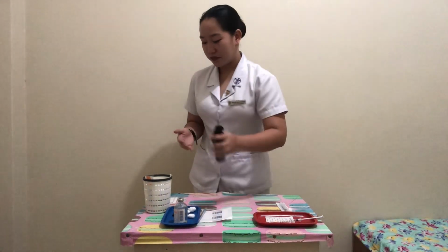Now for intramuscular injection, we will be preparing medication from an ampule. So I'll just perform hand hygiene first to deter the spread of microorganisms and avoid cross-contamination. First, we'll have to read the doctor's order in the AR and compare the label on the ampule to make sure that it is the right medication being prepared.